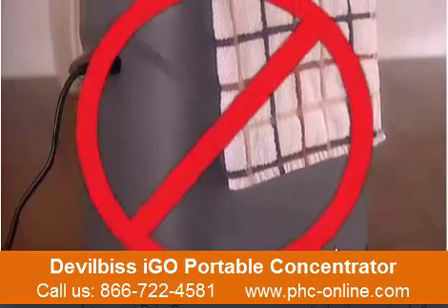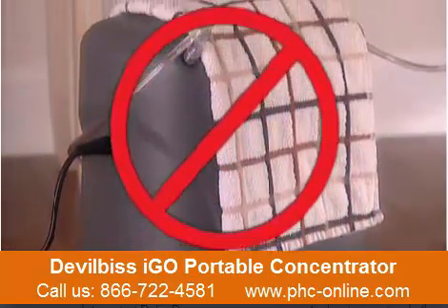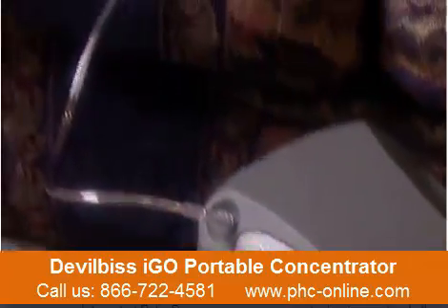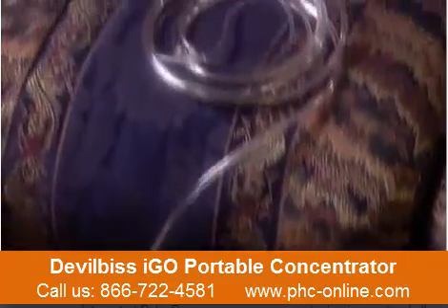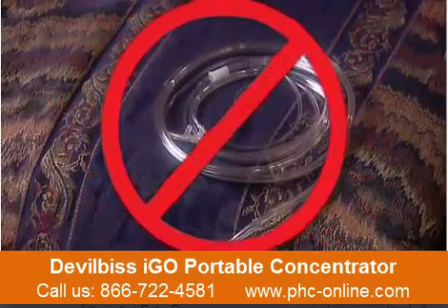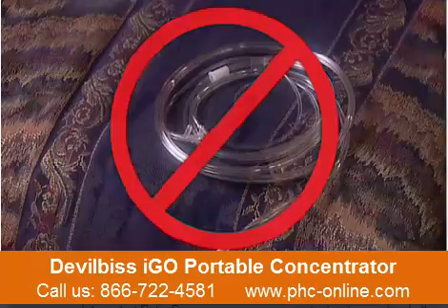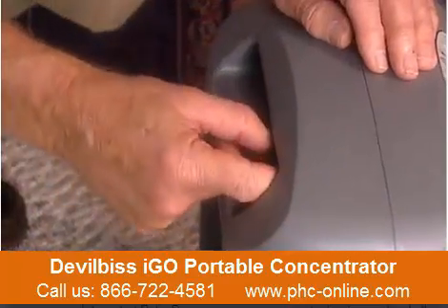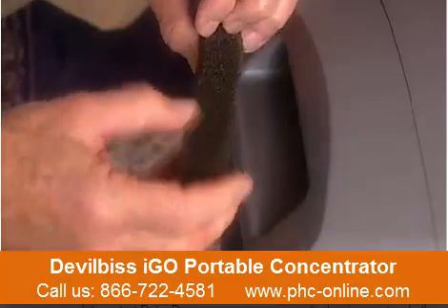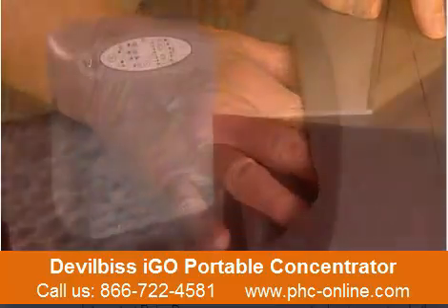Never cover your iGo system with a blanket, towel, or other covering to avoid overheating. And never leave the unit running when not in use or the cannula unattended when delivering oxygen. High concentrations of oxygen can cause rapid burning. Finally, prior to operating your system, check to see that the air filter located in the handle cavity is clean.